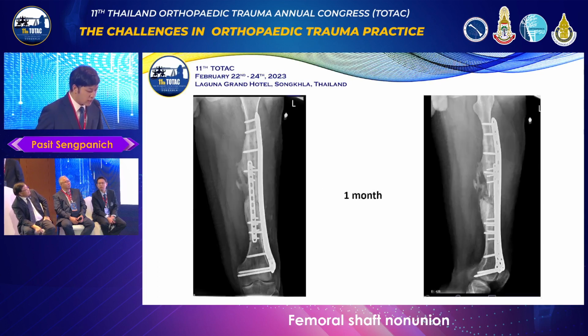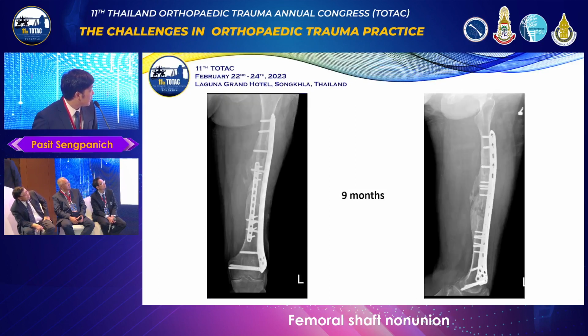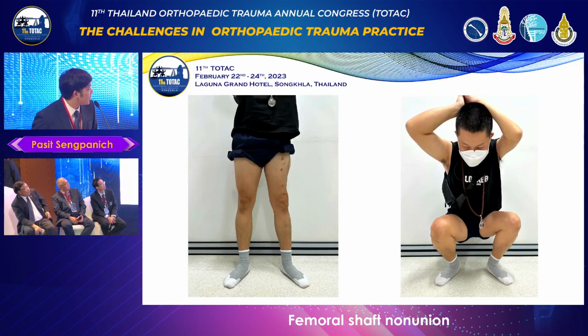Yeah. And this is a post-operative film at 1 month, 3 months, 6 months, and the last is 9 months. And this is the clinical picture of the patient.